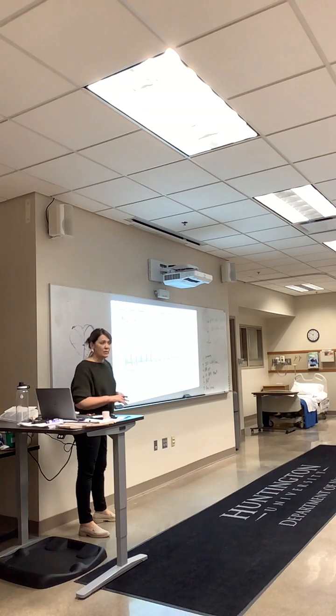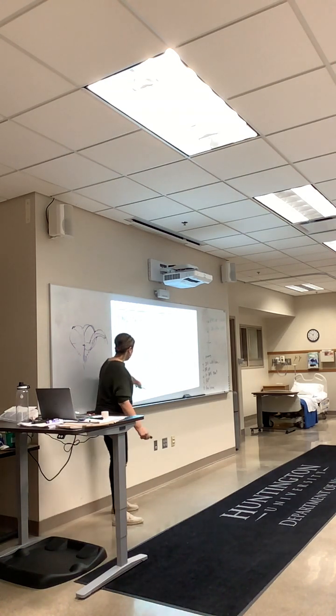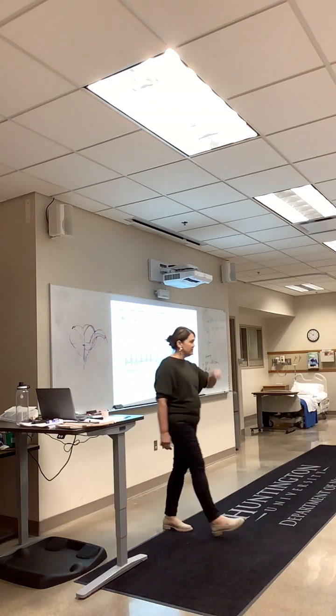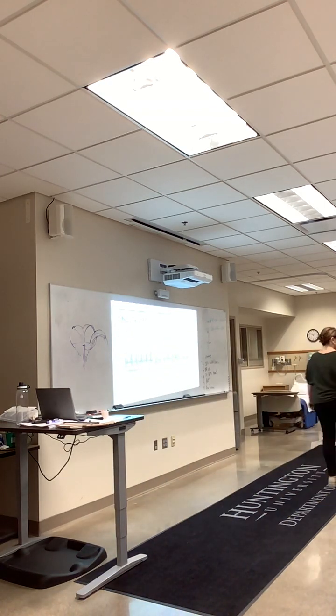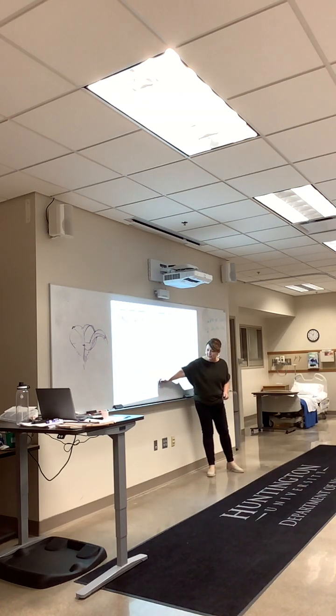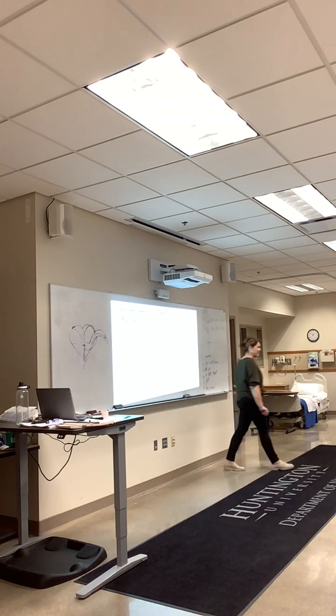So this is sinus tachy as well. I just wanted you to see the difference. In this one, these are starting to bump together. In these, I can see a little separation here. So what does bumping together cause? It's not going to cause a problem. It's just harder to read. I'm going to show you where it's going to be a different reading. I don't care if the P wave hits my T wave. I just don't want my QRS to hit my T wave. We're okay still. It's getting a little closer here, and this one is a little bit closer here, but it's still sinus tach. This is still sinus tachycardia. Do you guys think you can identify those?